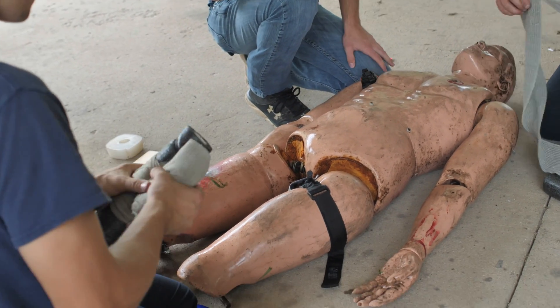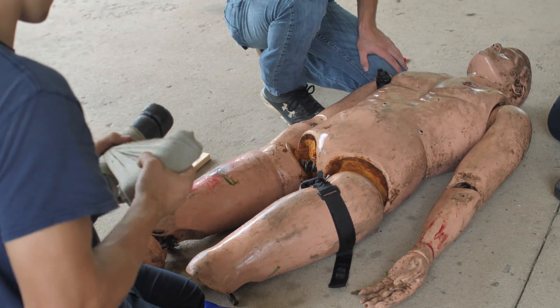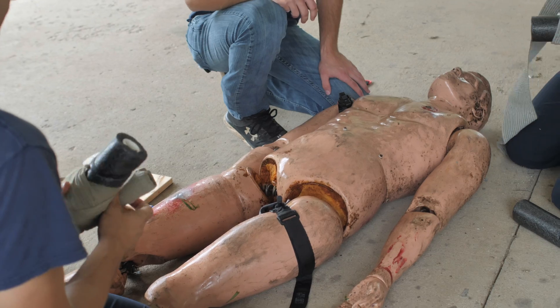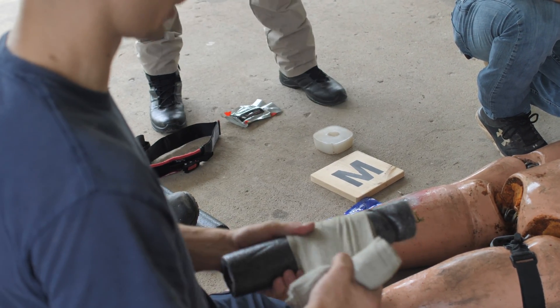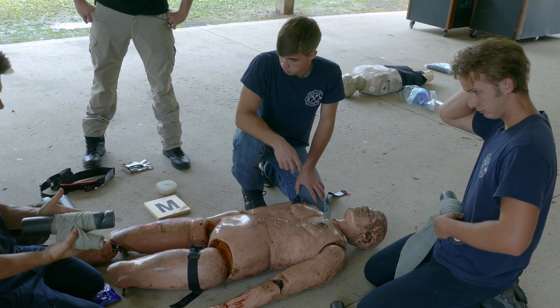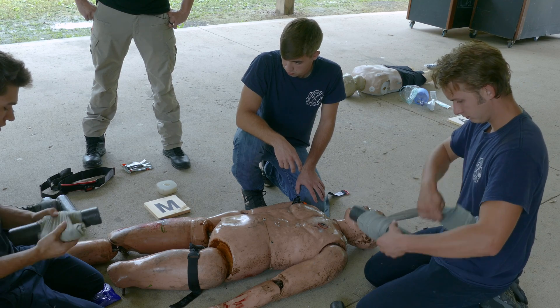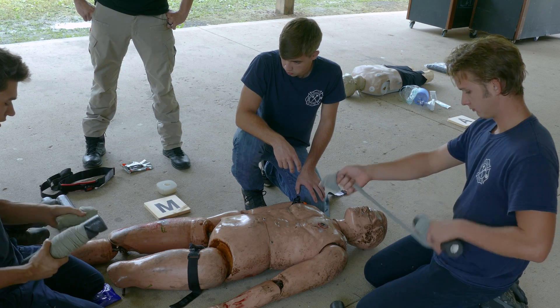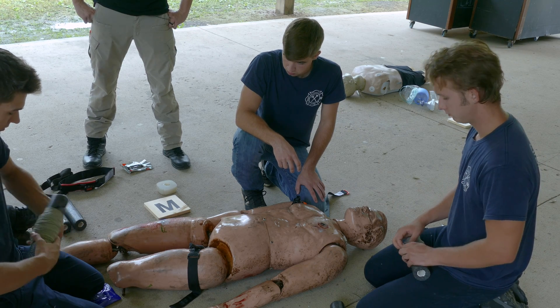Same thing with CelOx — that'll be three minutes for that type of hemostatic as well. Pierce, explain to everybody what you're doing by twisting. When you're wrapping around there, you can put a lot more pressure on a certain spot when you twist it — you have a lot of surface there on one side and it funnels all the pressure in the middle wherever you twist it. Then you go back to wrapping to keep the bandage still, so you can adjust where you do it to make even pressure over the whole thing.